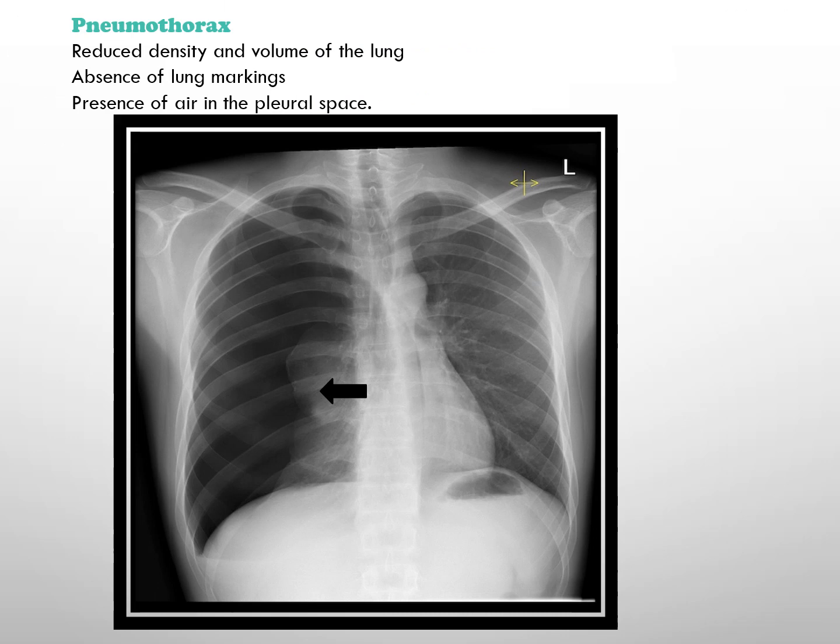This x-ray shows pneumothorax, which is identifiable on chest x-ray by the reduced density and volume of lung on the right side. It is characterized by the absence of lung markings and the presence of air in the pleural space.